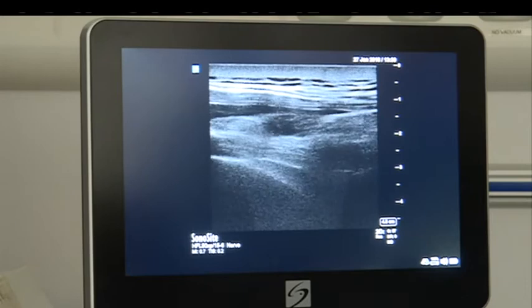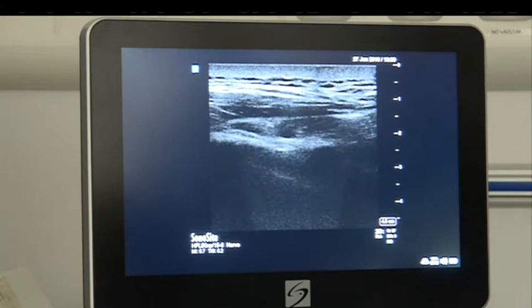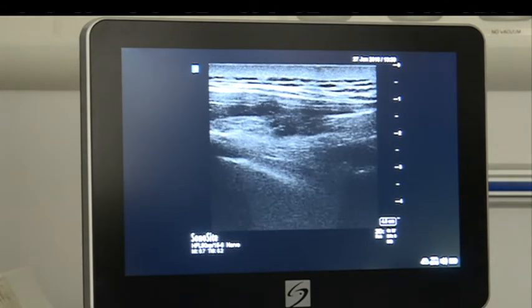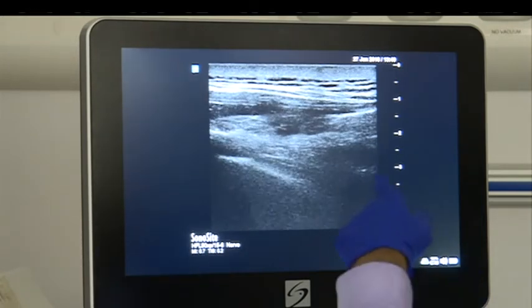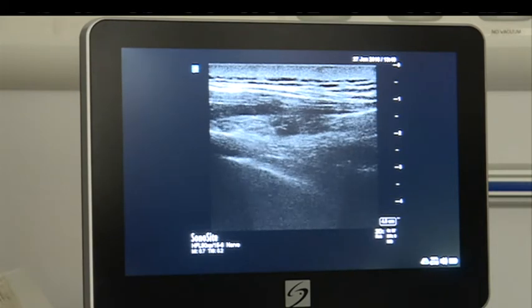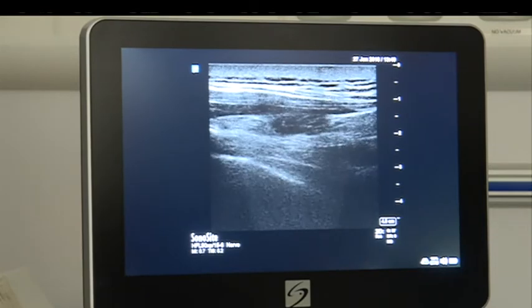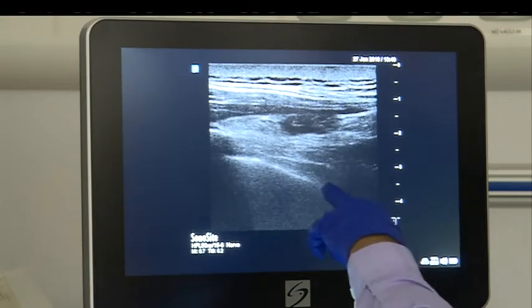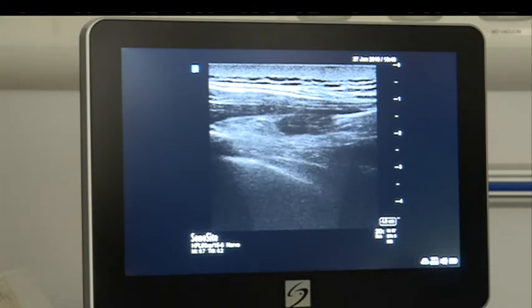If you are getting confused, move it onto the rib again — is it really the transverse process? Yes, it is the transverse process, then slide there. What you want is not to see the transverse process ideally, so keep that shadow on the lateral side of your screen. You can then nicely see the intercostal membrane and pleura — that is the wedge-shaped space where you have to put your needle in.